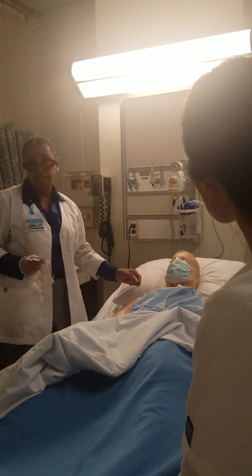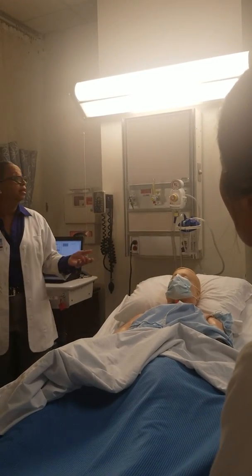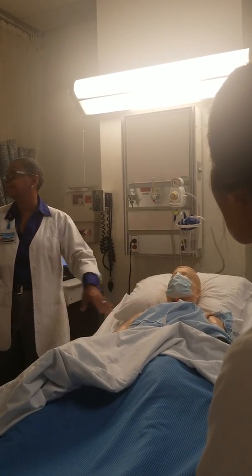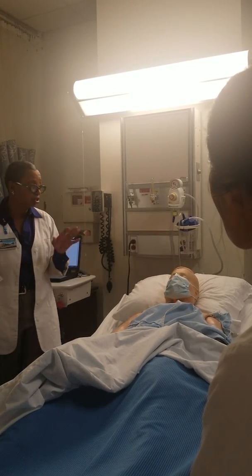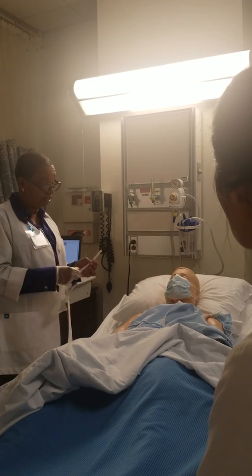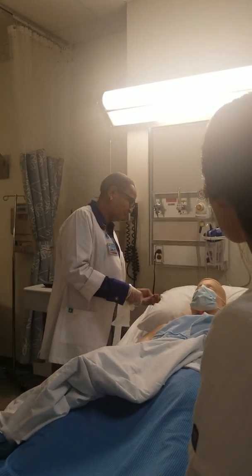Be careful with these that we have. They're not sutured, so they will come right out with your dressing. I mean, you could be pulling this thing off and have it right in your hand. If that happens to you, just say, hey, this is normally not supposed to happen.